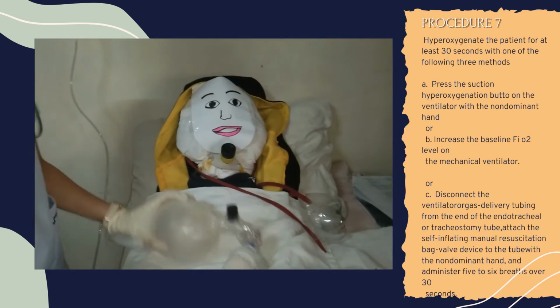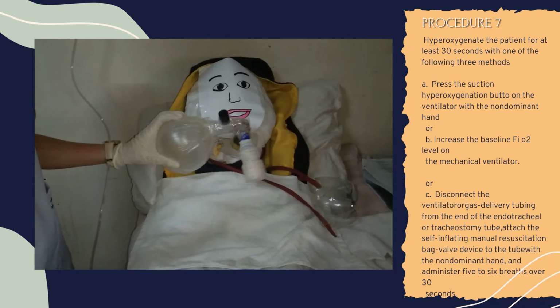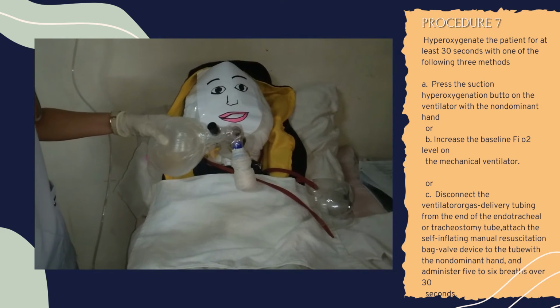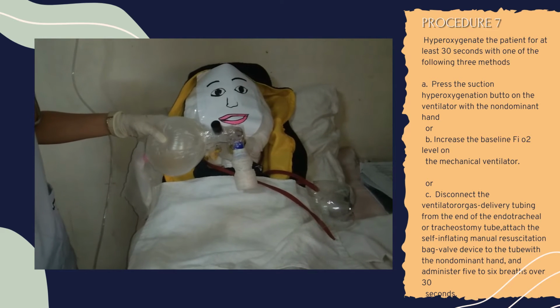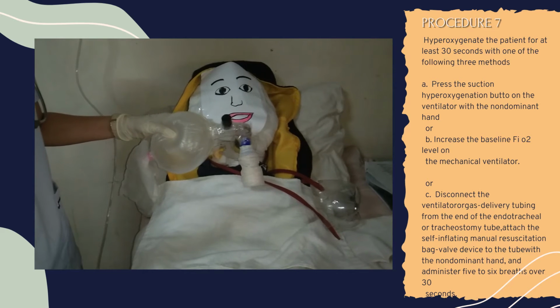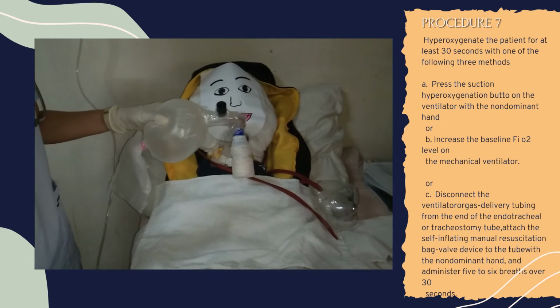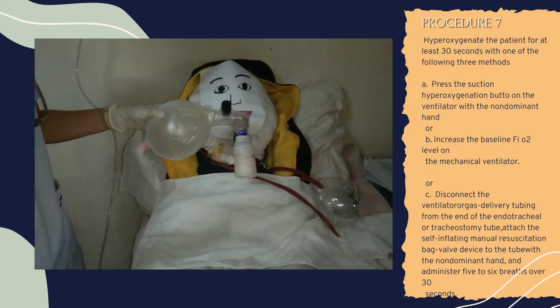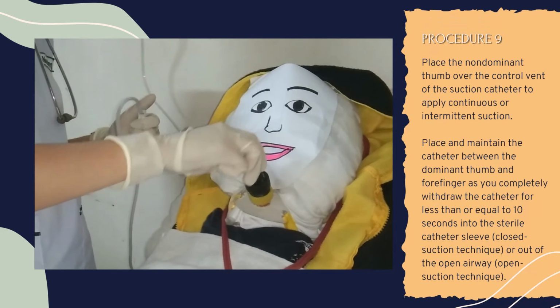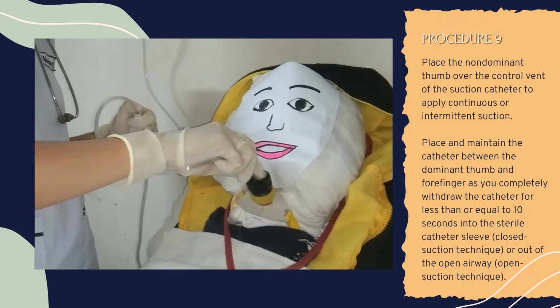Or disconnect the ventilator or gas delivery tubing from the end of the endotracheal or tracheostomy tube. Attach the self-inflating manual resuscitation valve device. This verifies that 100% oxygen is delivered, where some models of manual resuscitation valve entrain room air and deliver less oxygen. Remove the ventilator circuit or self-inflating manual resuscitation valve device with the non-dominant hand.